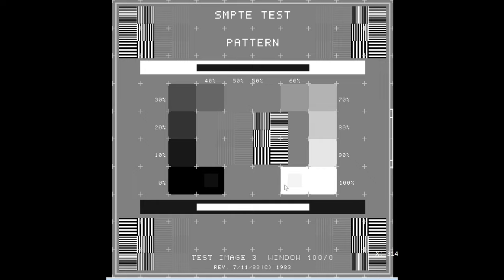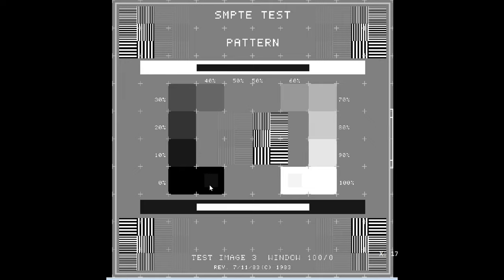The next thing that you're going to look for is the 5% patch, which is right here. You can see this is a 5% patch that's inside of the 0% patch. And so as long as you can see that patch, then we can pass that portion.